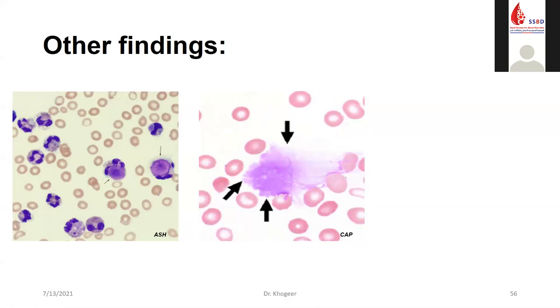These cells are ruptured white blood cells, leaving their nucleus free, and they can be pathologic and non-pathologic. A non-pathologic cause may occur during the smearing process. Smudge cells are produced if there is heavy pressure on the spreading slide, and a pathological cause of smudge cells may be leukemia. And in the lab, an albumin preparation can be used when many basket cells are present, for cellular preservation in order to identify these cells.